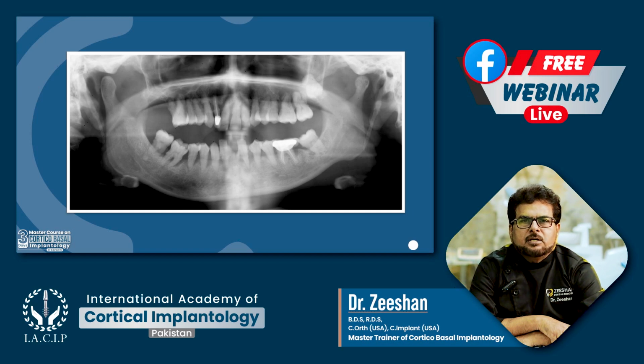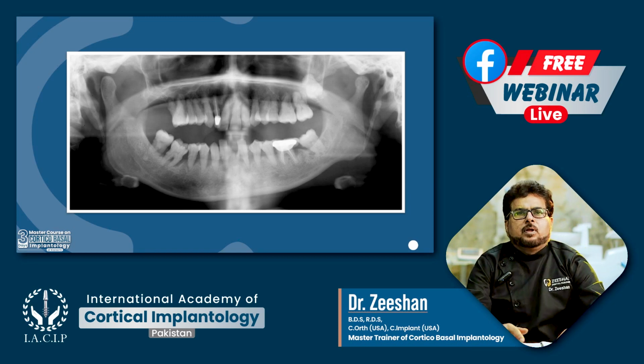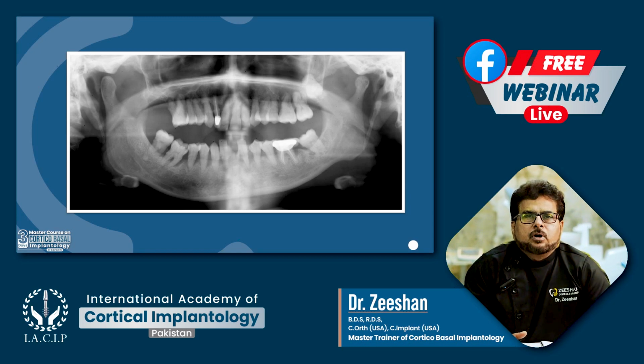So he wants to restore his jaw immediately. As you can see in this case, we have upper jaw, very less bone, soft bone, less bone, bone density is low, and we have to extract all these teeth, and he wants to restore it immediately.